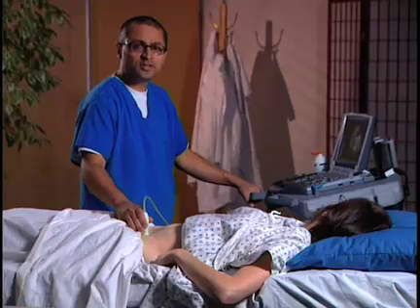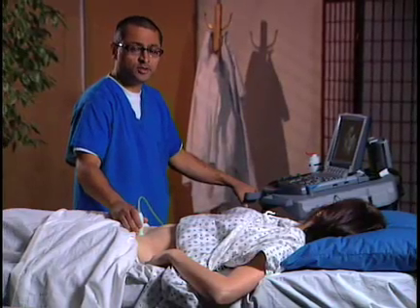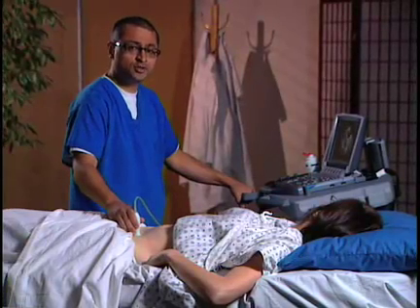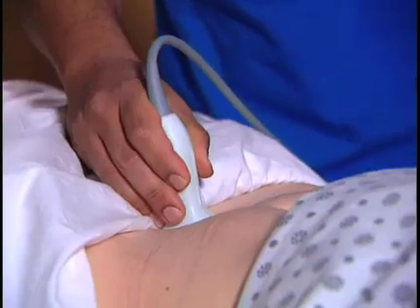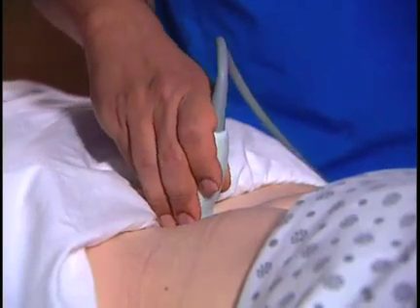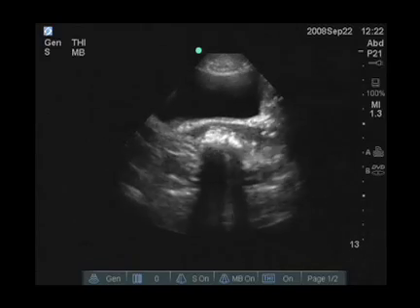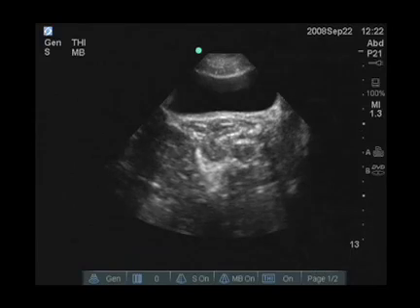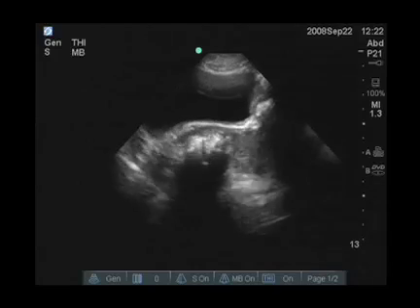Once we finish the sagittal view, we want to go ahead and do a transverse view. We're going to point the transducer marker toward the patient's right — so we rotate that transducer toward the patient's right. We see the bladder in the center of the screen. We're now going to scan from inferior, just below the symphysis, to more superior.